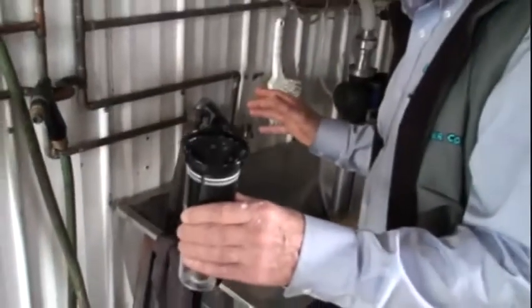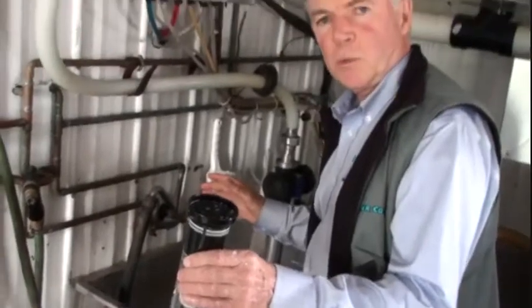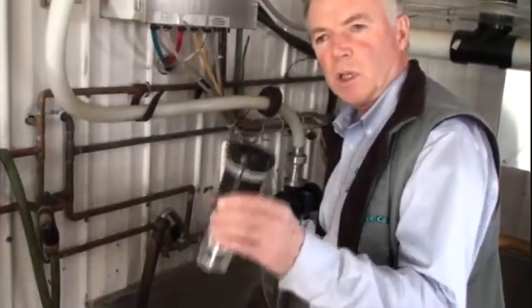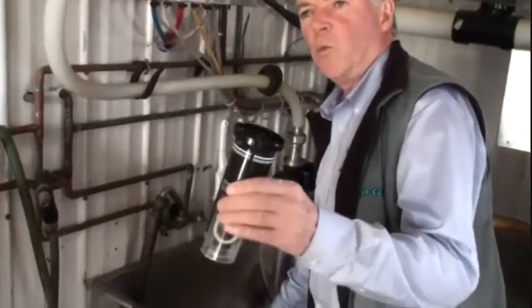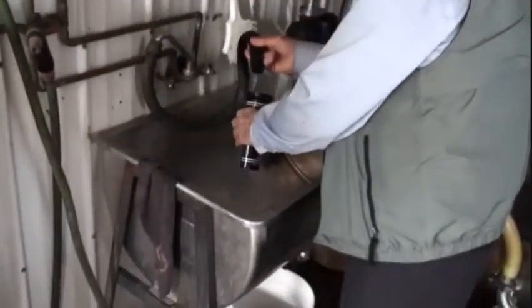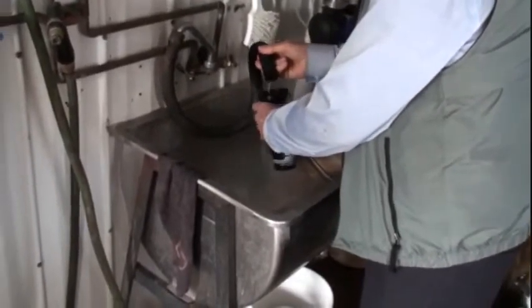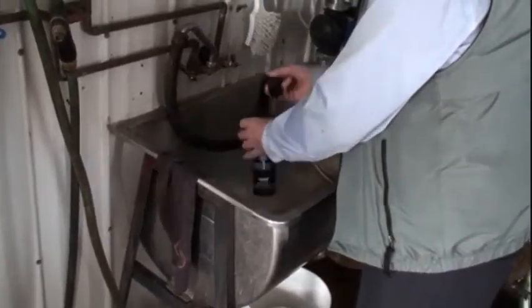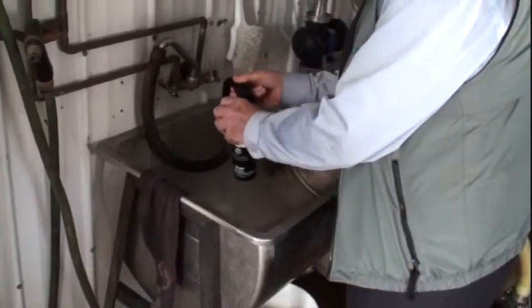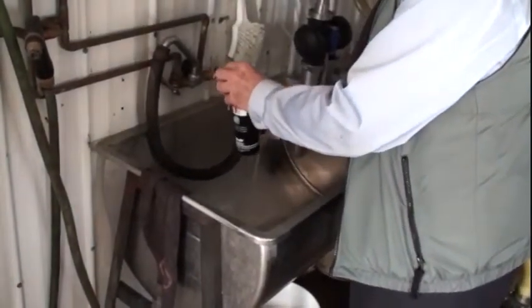The only maintenance involved with this instrument, after we've used it on our herd or group of cows, is just rinsing it out with water of any temperature — just putting some water in the top and letting it run through the instrument until it looks clean.